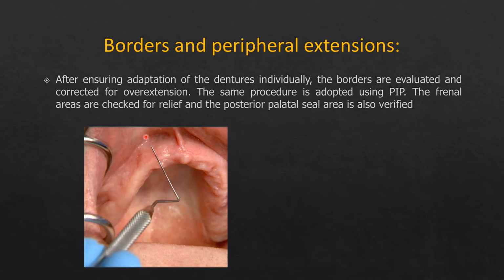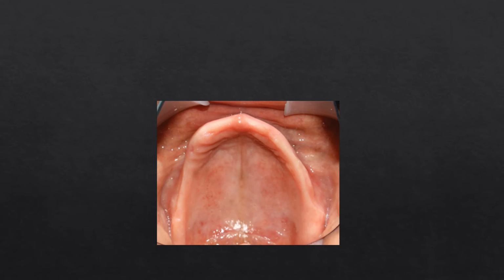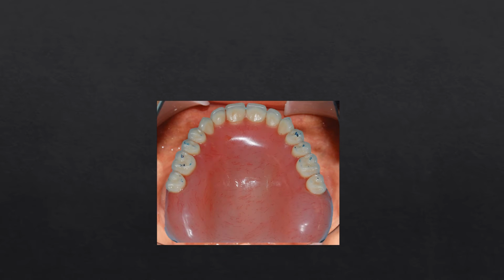You can use a periodontal probe to place in the patient's vestibule and measure the vestibular depth, and then similarly you can also verify it on the dentures using the same periodontal probe, or you can just simply insert the denture in the patient's mouth and do all the border movements like you do in the secondary impression step, and you need to check visually for the relief or overextension of the denture borders, denture flanges, all these things in the patient's mouth, and any discrepancy should be relieved then and there. So this is what we are talking about, the clinical steps of denture insertion, verification.